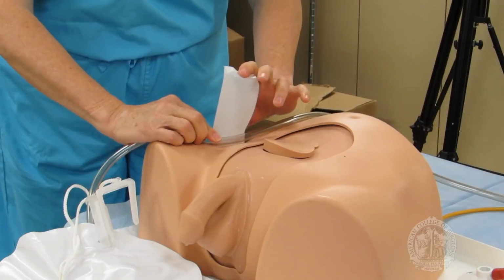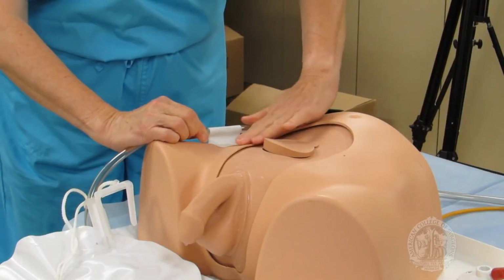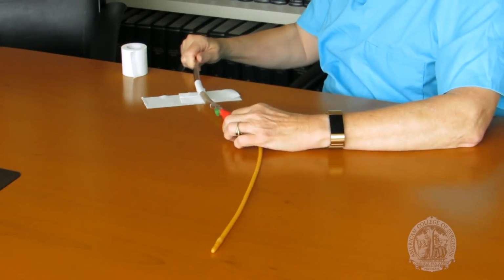If there's no stabilization device provided, use 2 pieces of tape to secure the tubing to the patient. The first piece of tape goes directly on the patient's leg, under the tubing. The second piece of tape goes over the first, around, and is taped to itself before it's taped down. This provides a mesentery that provides a lot of stability for the tube.